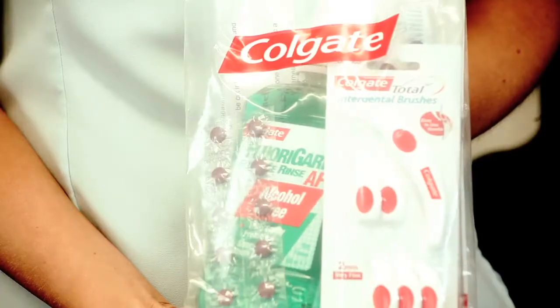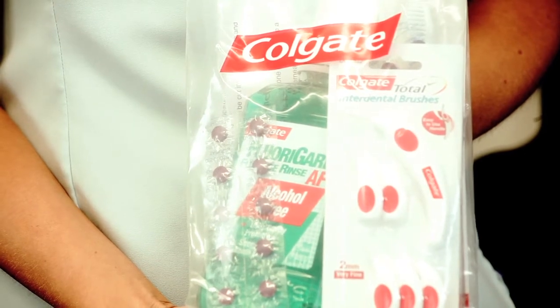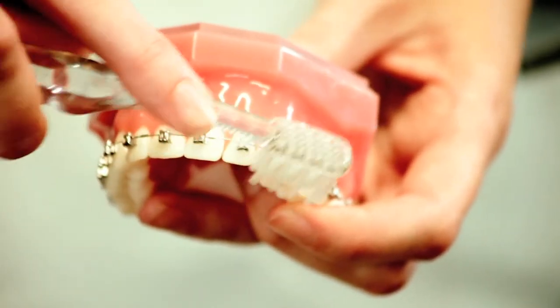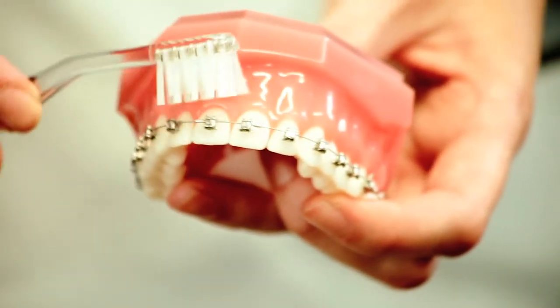Brushing your teeth takes a bit longer to make sure you get them clean. We recommend you buy our brace care kit and top it up with individual items as you run out. Brushing is very important. In the kit there is an orthodontic toothbrush with extra long ends so you can get underneath the wire and clean around each of the brackets.